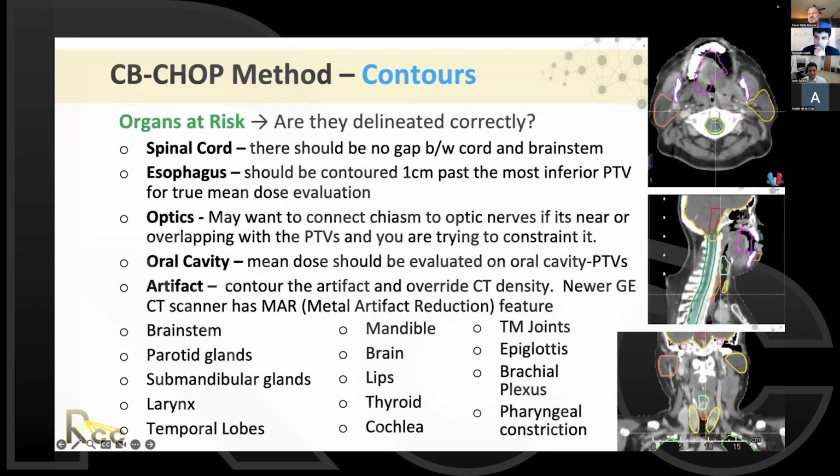Excellent. And you know better than me, you, Amir and Nauman, but there are a lot of good atlases that you can refer to for contouring, especially ORs, but targets too. So they are accessible in general to everyone. So I know RTOG has good atlases and you can learn how to do that.